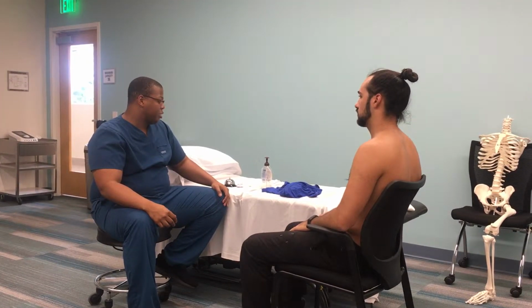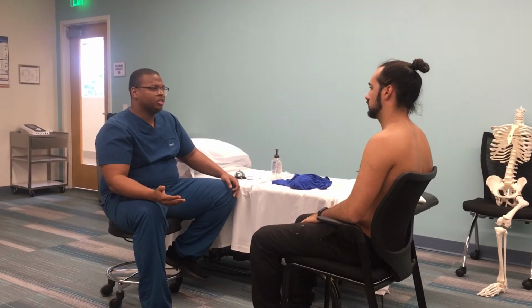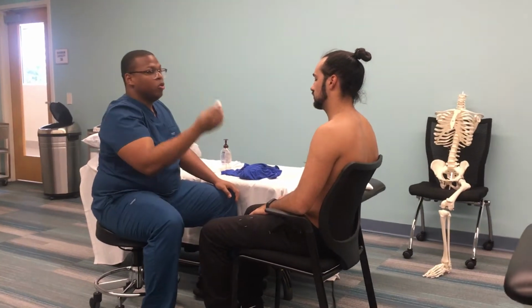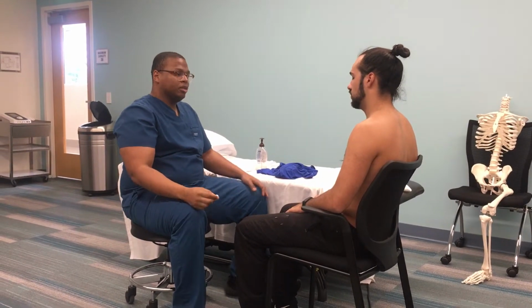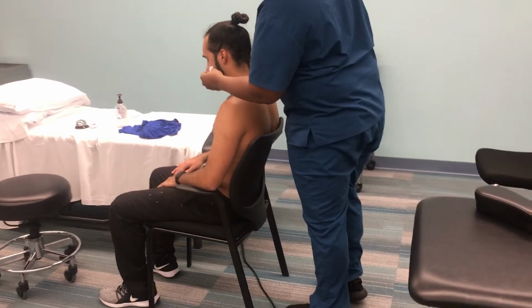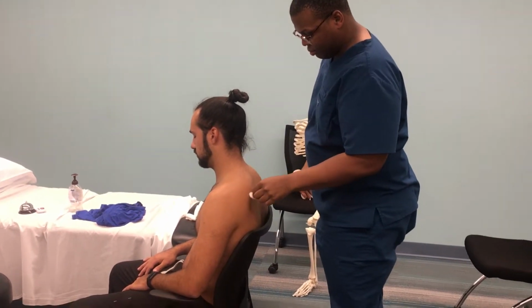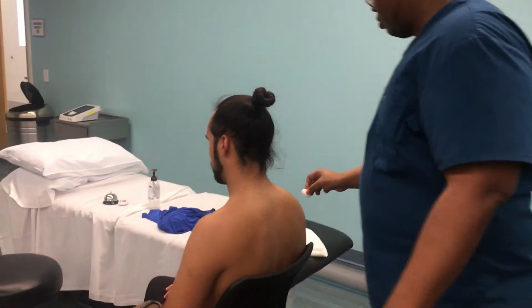Okay. So what we're gonna do now, before I even start, I wanna check your light touch sensation. I want you to tell me when you feel this, and it's gonna be on your upper trap. When you feel it, I want you to say yes. If you don't feel anything, don't say anything, and I don't want you to guess, okay? Okay. All right, so essentially, I'm gonna be back here. You can close your eyes. Remember, this is a baseline, how you feel. Say yes if you feel it. Yes. Yes. Yes. Yes. Okay, good.